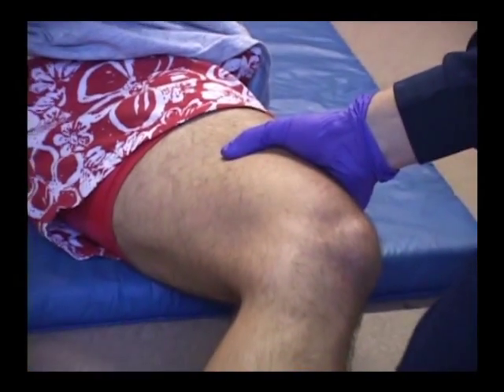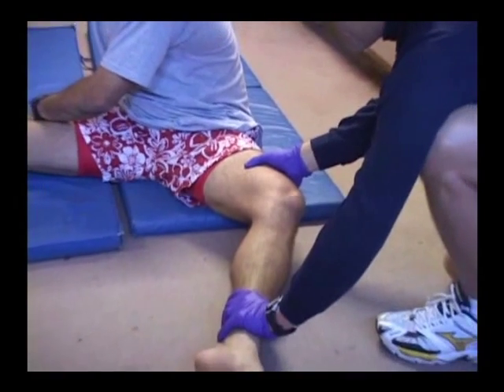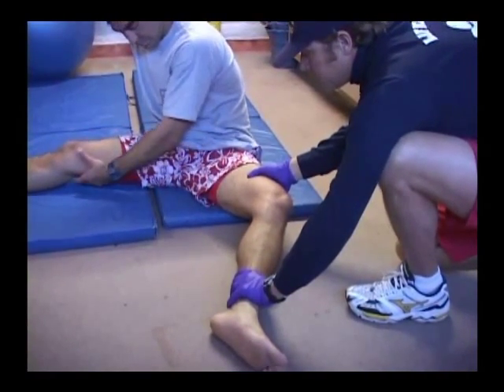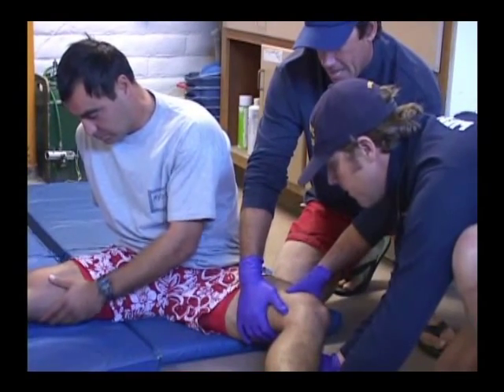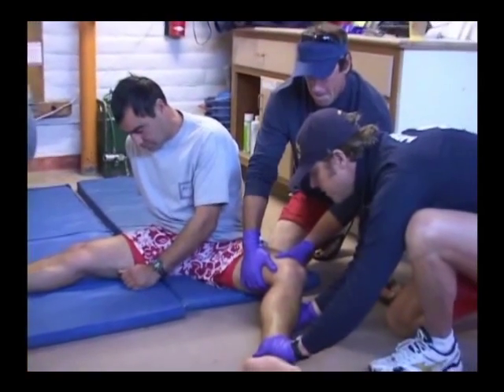Apply constant yet gentle long axis, that is, in-line manual traction on severely deformed long bone fractures. Return the extremity to its normal anatomical position with an assistant supporting the extremity under the suspected fracture site.